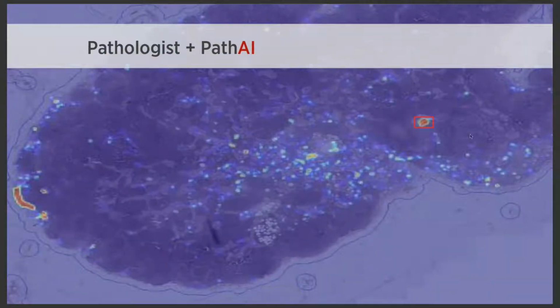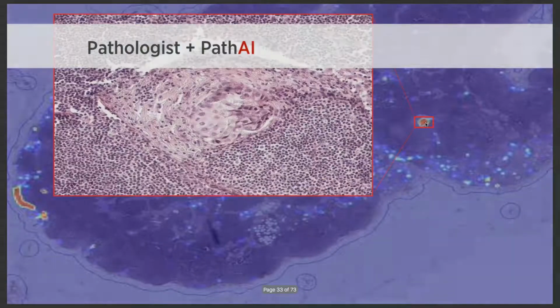And here's another one, where again now you can see from low power. It's like a satellite image or something, where you can focus immediately on this little red area that, again, is a tiny pocket of like 10 cancer cells amid hundreds of thousands of normal cells, now visible from low power.